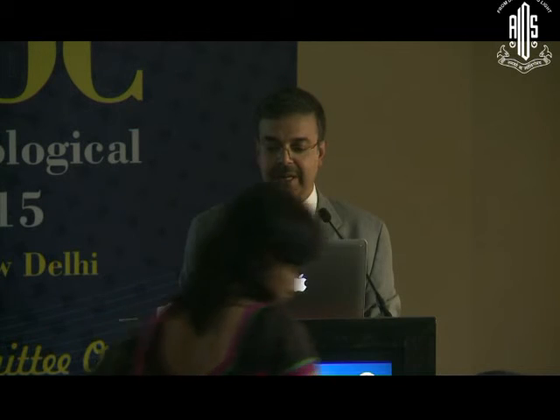Now you need to manage the vitreous here. You have to be careful, inject triamcinolone, and as in the previous videos we saw good, efficient use of triamcinolone. It really saves the day. It's so easily available now. Every surgeon should have it in his armamentarium, and clear up the vitreous, and you'll be able to save the day. So here we were able to subsequently, after clearing the vitreous, get the cortex out, and you have to be a little patient here not to disturb the vitreous again.